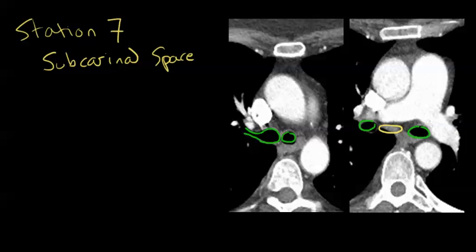Over here is the esophagus. And then you've got your pulmonary artery right here — this is the main PA, here is the left PA, and here is the right PA. You can see how the right PA is directly in front of the subcarinal lymph nodes. Over here you've got the superior vena cava.